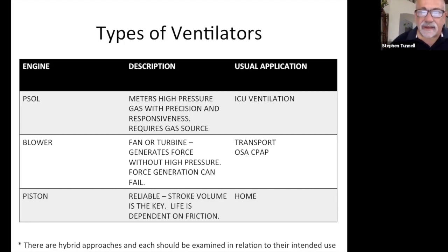You need to then have a set of tanks, or an oxygen tank, and the ventilator itself has to come with something called a compressor. Now, our ventilators are built with compressors inside, so it's a great feature, I should say, not an option, for our proportional solenoid ventilators. And one of the downsides for the care staff is that they have to source all of these things, the gases, in order to move the patient to somewhere like the operating room or radiology.